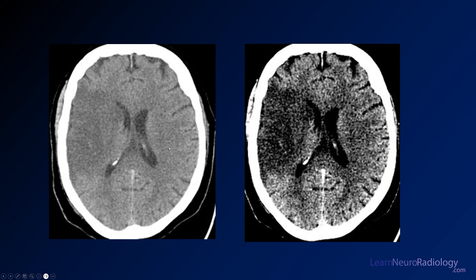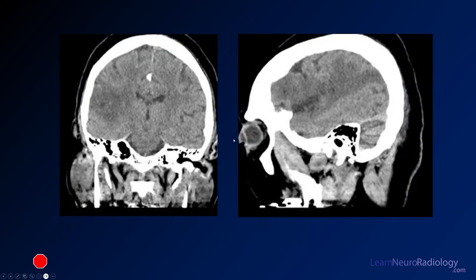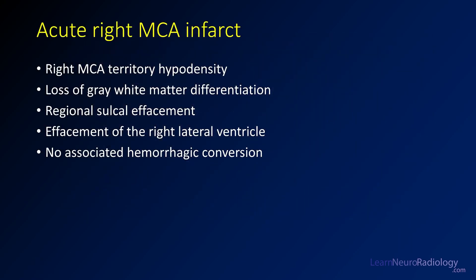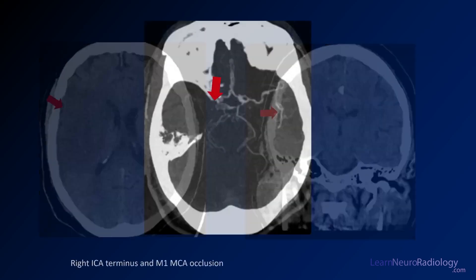Let's review the key CT findings. You can see the area of ischemia in the right MCA distribution. Windowing more harshly helps visualize the ischemia following a vascular territory, which is very important — it tells you you're looking at vascular pathology. There's a little effacement of the right lateral ventricle, indicating some swelling. On coronal and sagittal views, you again see loss of gray-white differentiation and areas of ischemia in the right MCA territory. Key findings: hypodensity, loss of gray-white differentiation, sulcal effacement, effacement of the right lateral ventricle, and no hemorrhagic conversion.